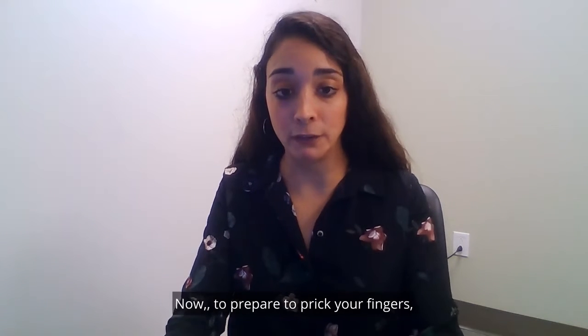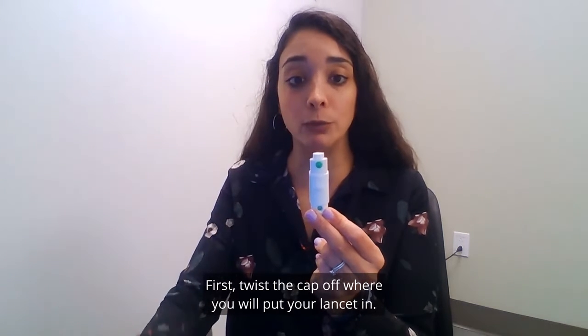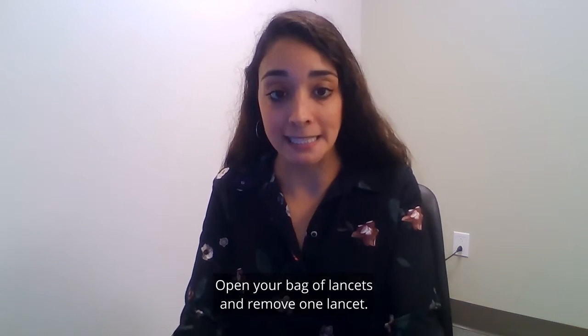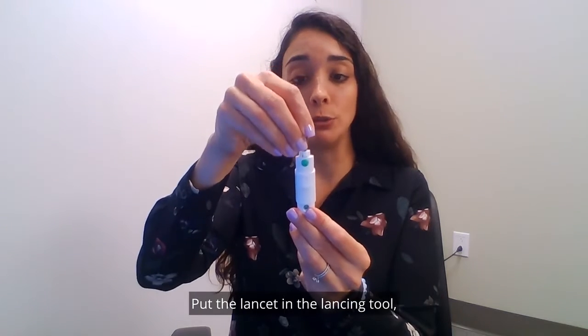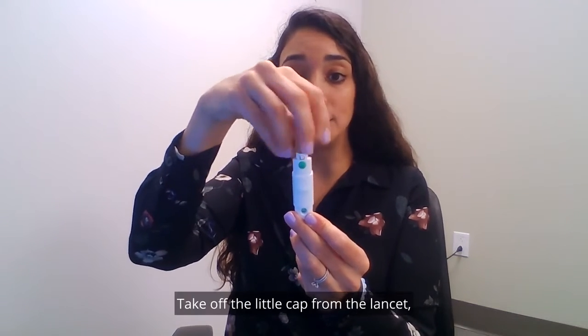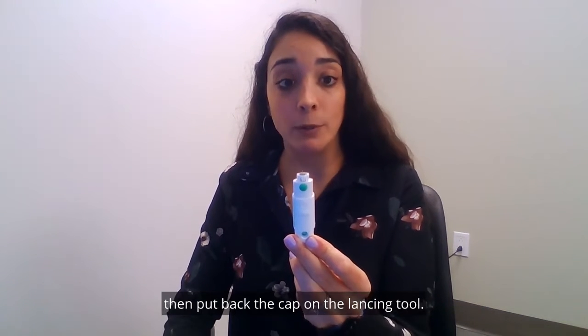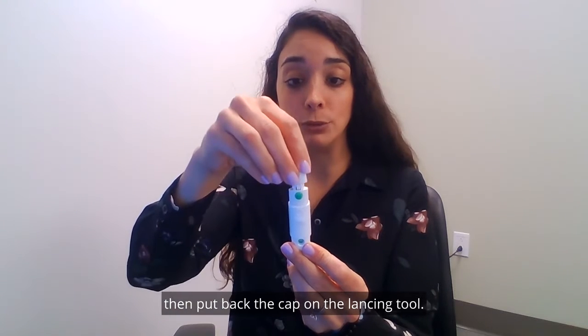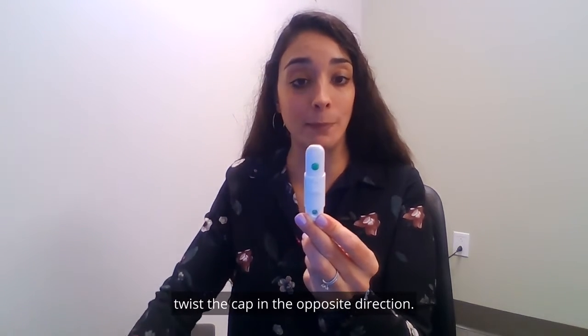To prick your fingers, use the lancing tool shown earlier. First twist the cap off where you will put your lancet in. Open your bag of lancets and remove one lancet. Put the lancet in the lancing tool and you will hear a click. Take off the little cap from the lancet so you can see the lancet, then put back the cap on the lancing tool.